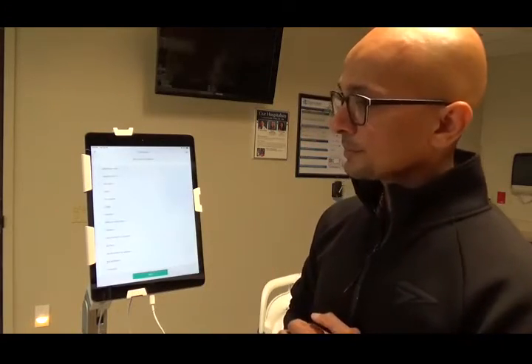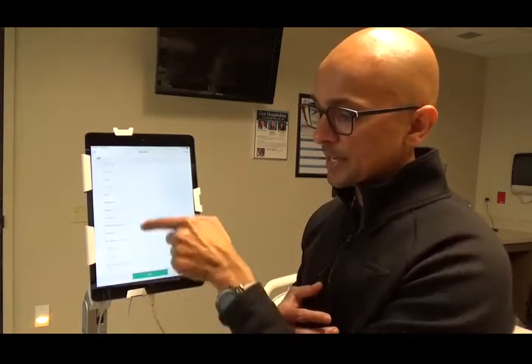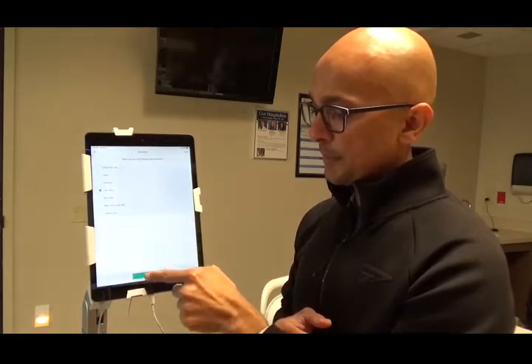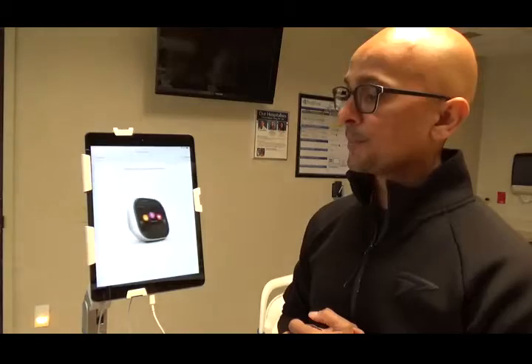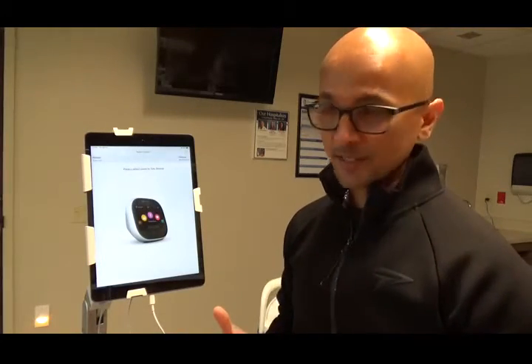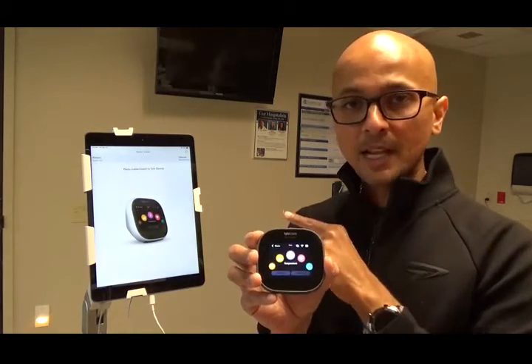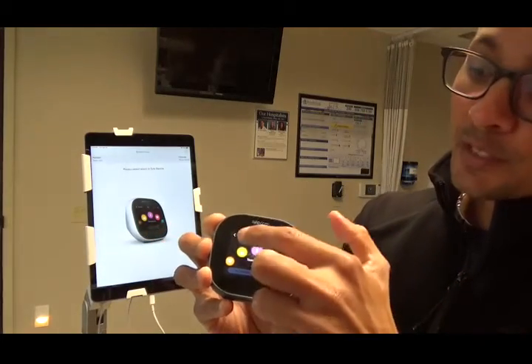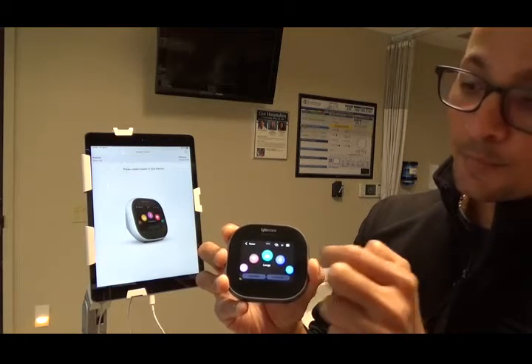So let's choose that. The chief complaint, HPI side of things, the same as your live exam, also has some COVID questions and the free text that you're able to put in. When did this start? And if any pain. And once again, like I said, you're able to skip these if you don't want to fill them in. And then it just goes directly to the exam, right? So this will really walk you through it. Now, instead of the live exam, you're the one here that controls this, right? So you decide what you want. So here, you scroll back and forth, and that's how you see all the exams.